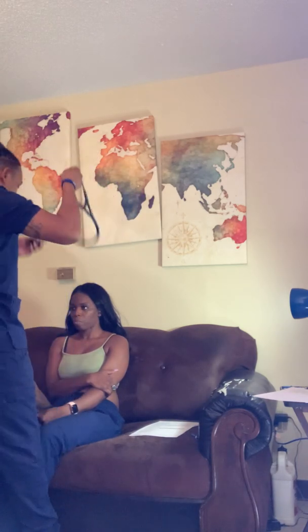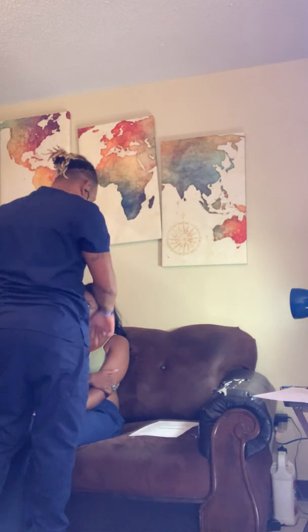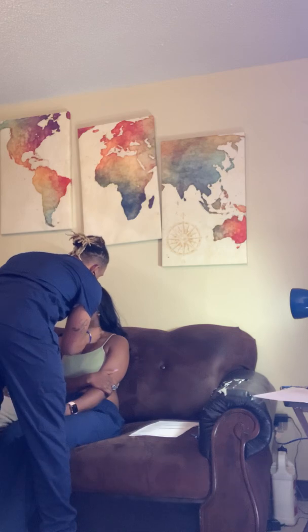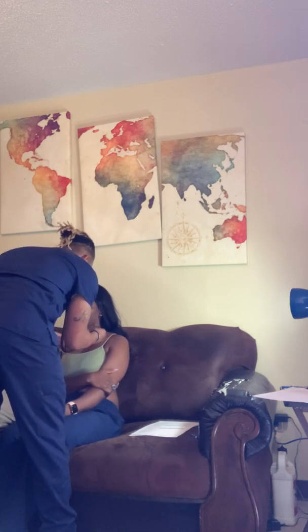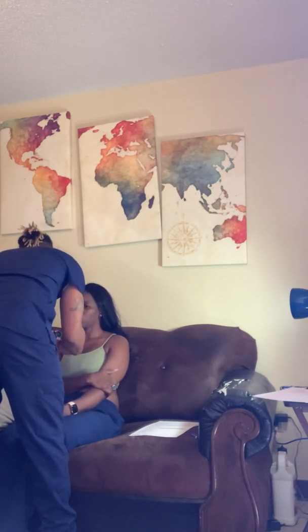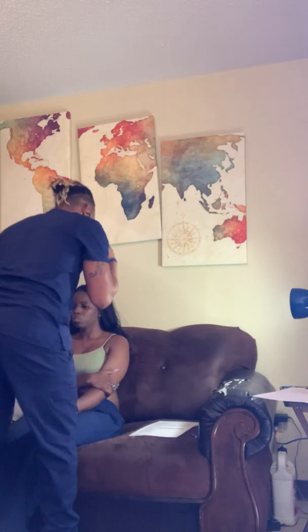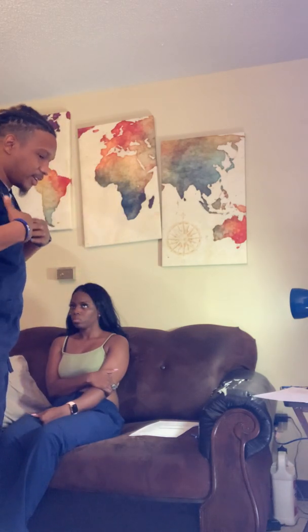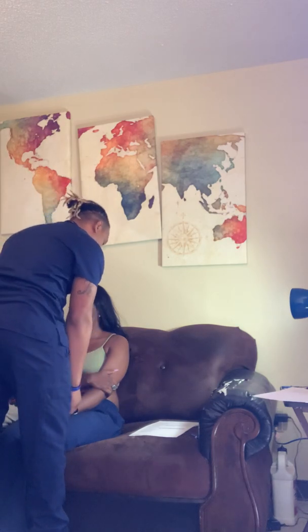Now we'll follow inspection and palpation with auscultation of the carotid arteries. I'm going to use the bell. All right. Upon auscultation, no bruit noted. Per palpation, no thrills noted.